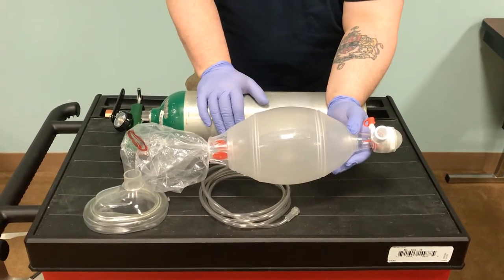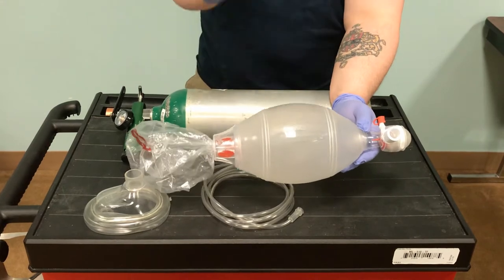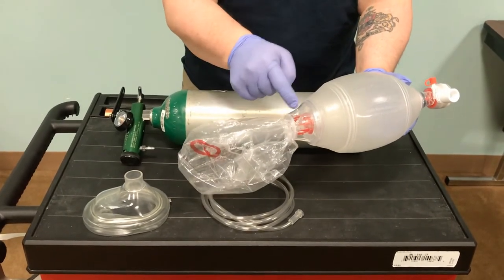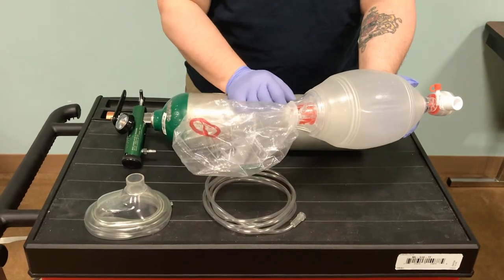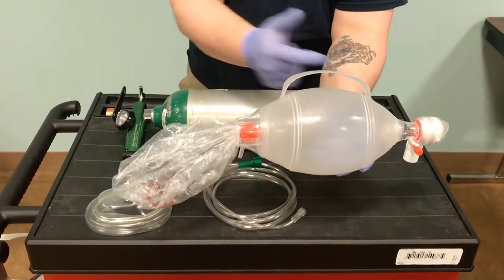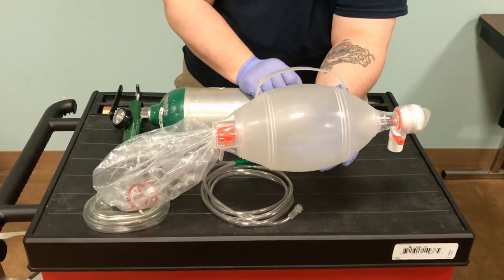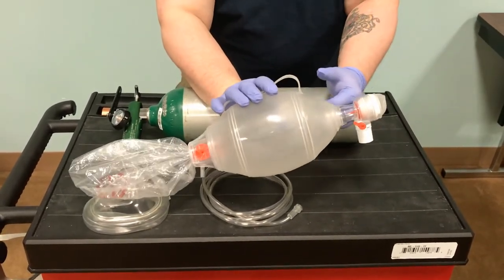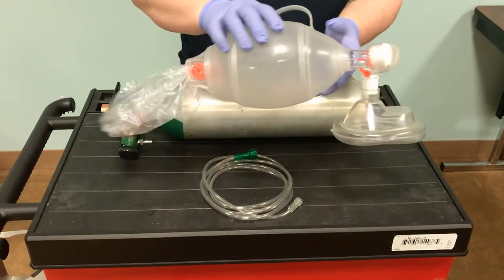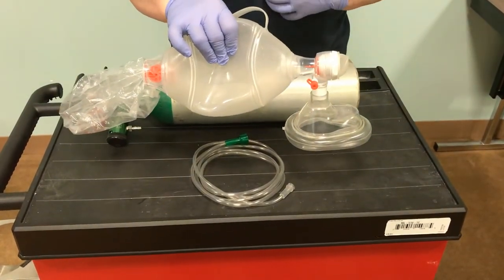All of these devices are now universal so we don't have compatibility issues when managing somebody's airway. This part here is our reservoir bag — this is where our O2 tubing attaches, and it's going to fill the reservoir bag. We squeeze the bag to deliver ventilation through this one-way valve. The oxygenated reservoir bag delivers oxygen through the bag and then through our mask. When the patient exhales, the mask attaches universally, forms a nice seal, and when we squeeze the bag it moves air — ventilation — down into the alveoli.